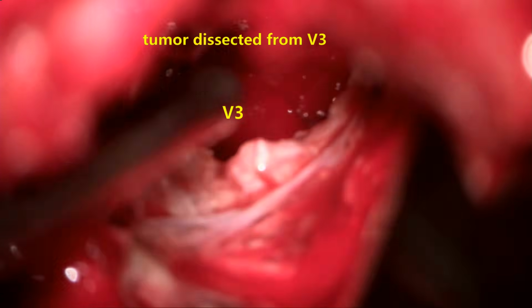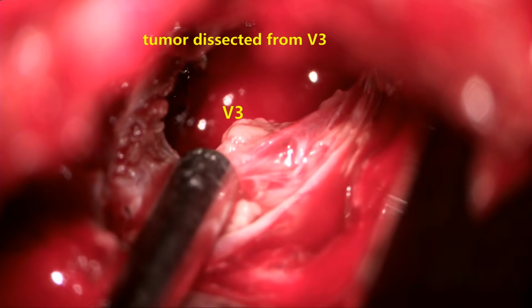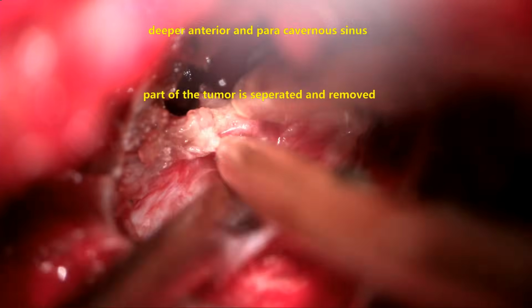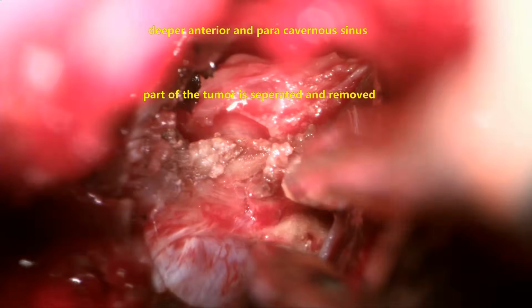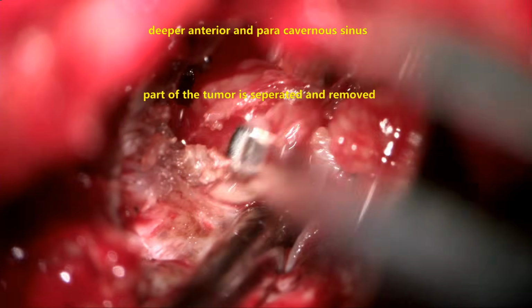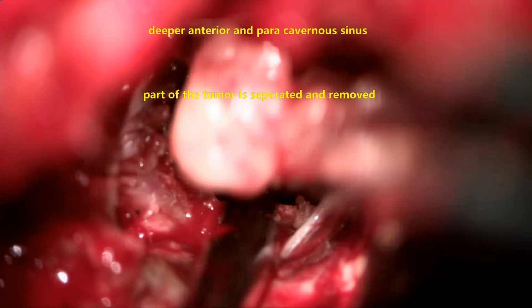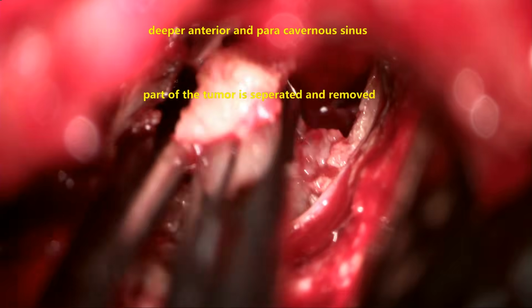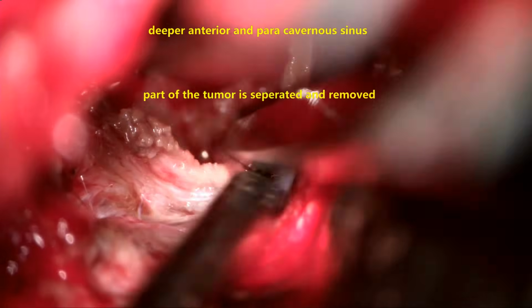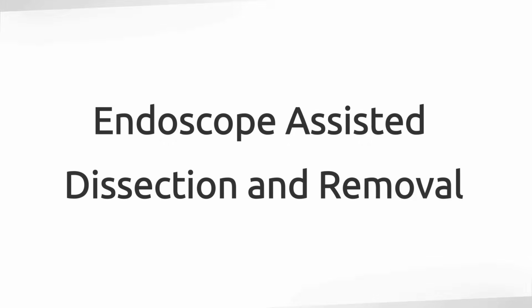Now we are separating the tumor from the third division, that is the mandibular division, which is pushed down onto the base of the middle cranial fossa, and that can be easily separated from the mandibular division, that is the anterior superior part of the tumor being separated. We are still not seeing the ophthalmic division because it will be shifted superiorly and medially, and we need to keep a watch on that.